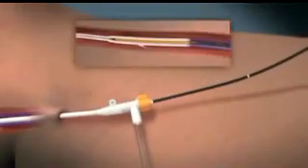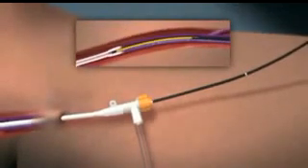Catheter shaft markings facilitate fast and accurate repositioning of the catheter at each segment.